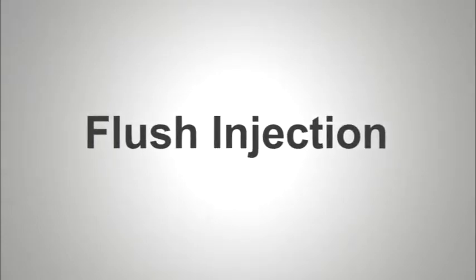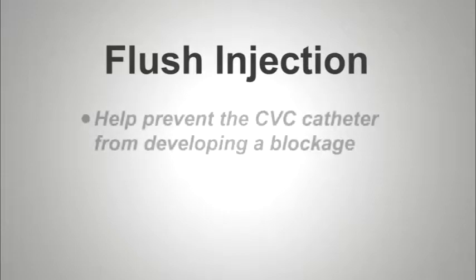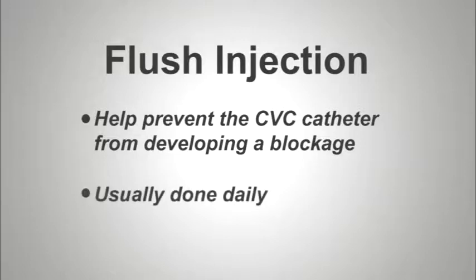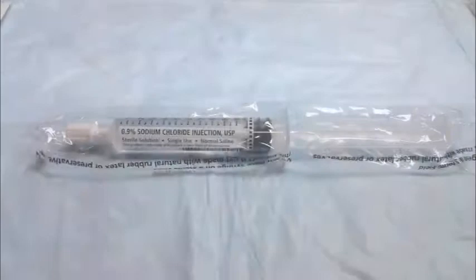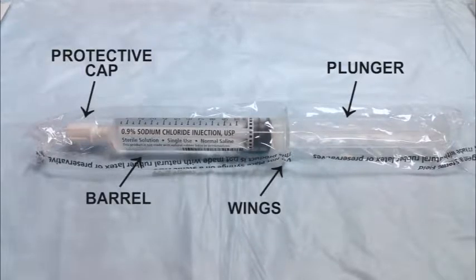Next, we'll talk about the flush injection. The purpose of the flush injection is to help prevent the CVC catheter from developing a blockage. The flush injection is usually done daily, or at least 3 times a week. Let's go over the parts of the syringe that you will be using. The parts include the plunger, the wings, and the barrel of the syringe with a protective cap on the end. The syringe contains the flush solution.